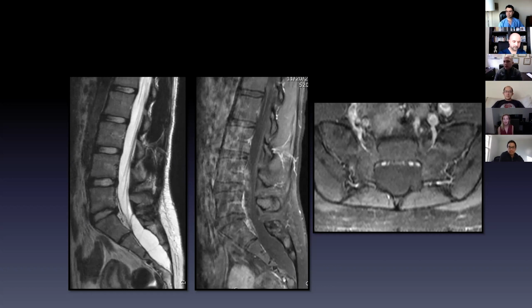Got it. And the second question was on the CT myelograms, when you're talking about monitoring the speed of the filling, just how fast are you talking about between the injection and when you're running your CT sequences? If you do it under fluoro, it takes a few minutes to get the patient off the table, get them over to CT, get them in. Sometimes that can take up to half an hour. If you're worried about fast leaks or flow into a cyst like this, if you do it on the CT table, I basically inject the contrast and get them scanned within less than a minute of contrast injection. So I can see immediately, even if it's very fast filling, what's going on.